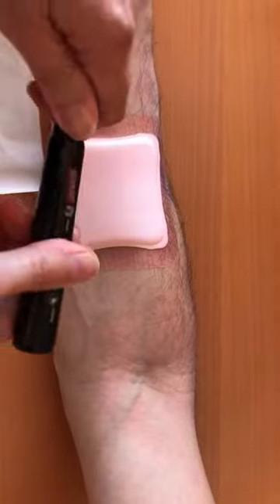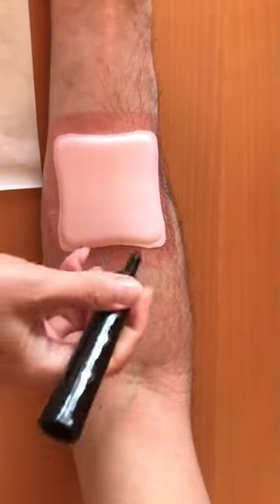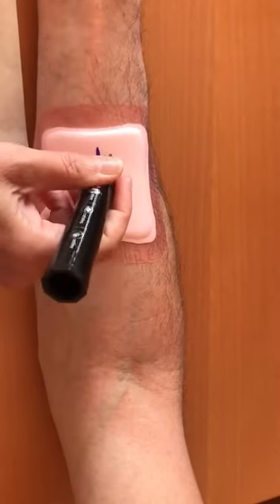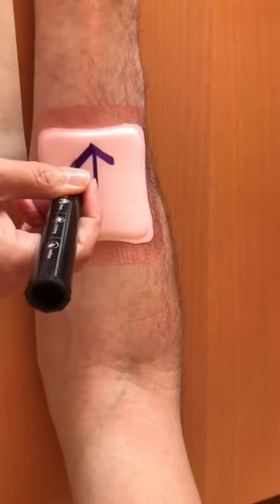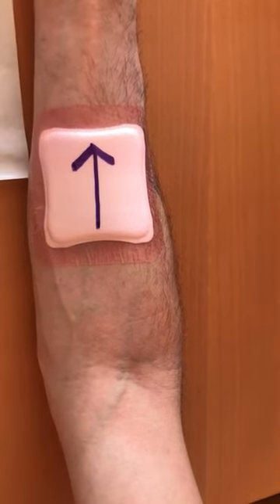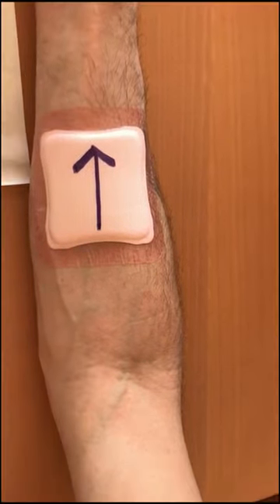It is vital that the dressing chosen will optimise wound healing and not increase the risk of further skin damage. On the top of the dressing, draw an arrow in the direction of the skin flap to indicate which way to remove the dressing, and make sure this is clearly explained within the notes, adding the date for reference. Consider using a skin barrier product to protect surrounding skin.